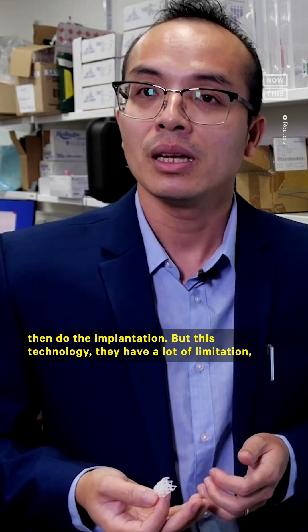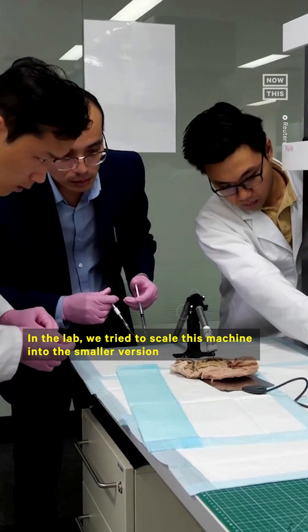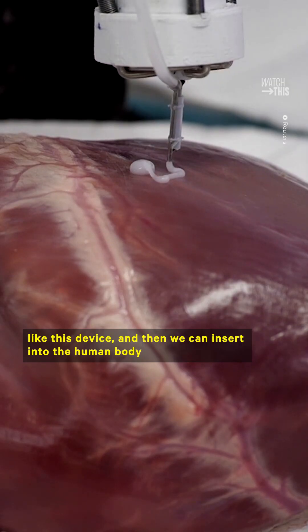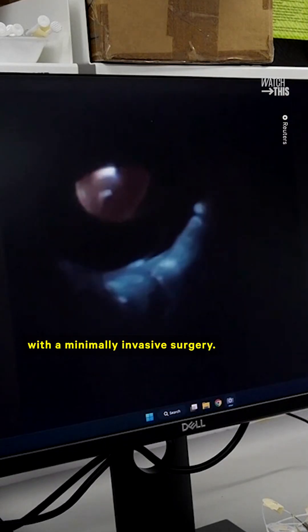But this technology has a lot of limitations: high infection risk and high blood loss. In the lab, we try to scale this machine into a smaller version like this device, and then we can insert it into the human body using natural orifices like the mouth or the anus, and we can even use it with minimally invasive surgery.